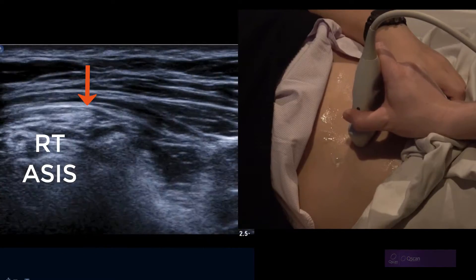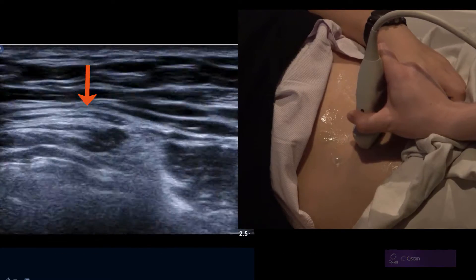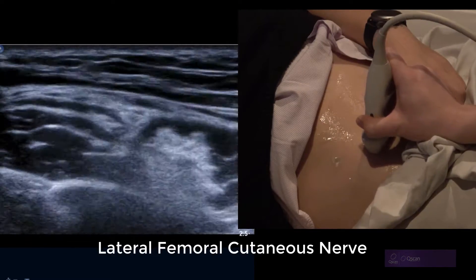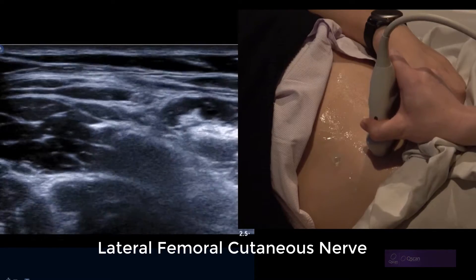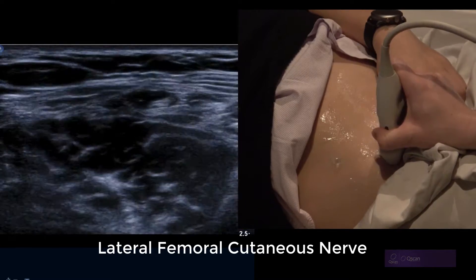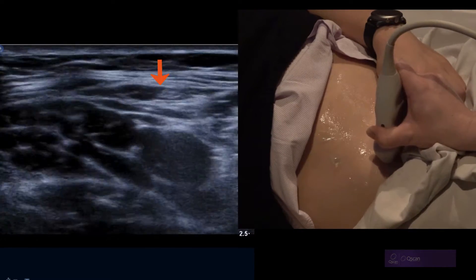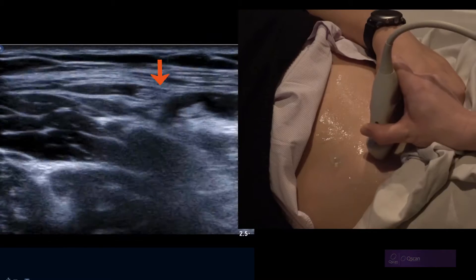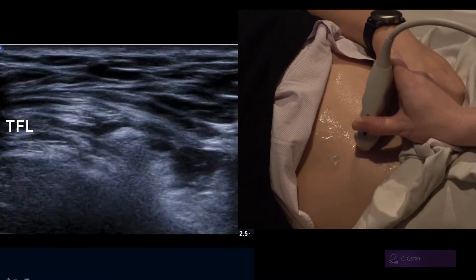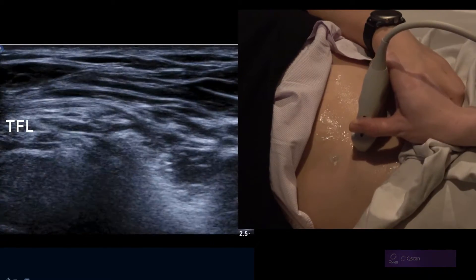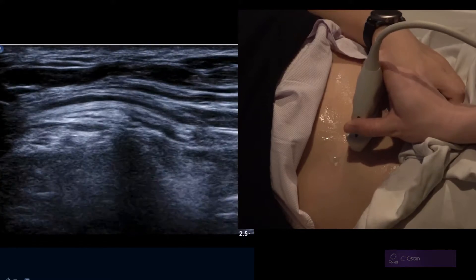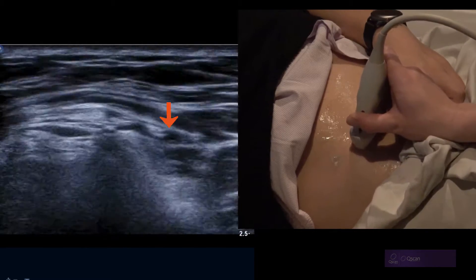We start with the transverse plane at the ASIS. We can just see a little tiny nerve emerge as you move the transducer south. This is it here. It's a superficial sensory nerve, sits between two layers of fascia, and it's closely related to the ASIS.